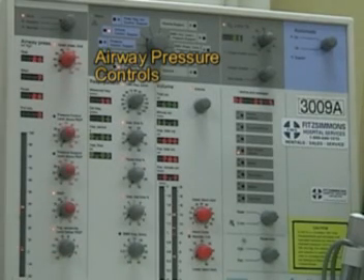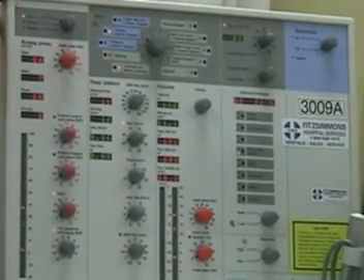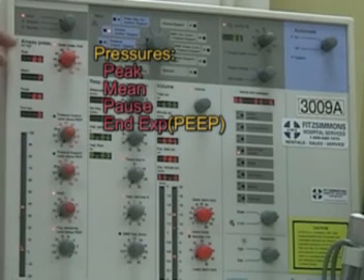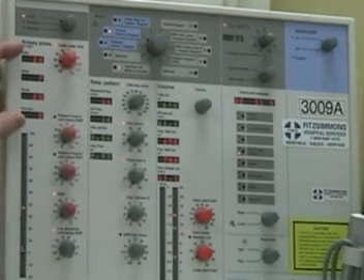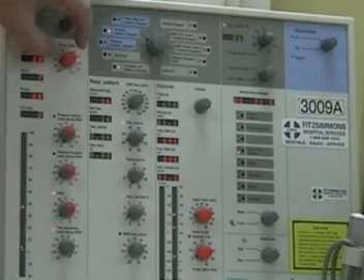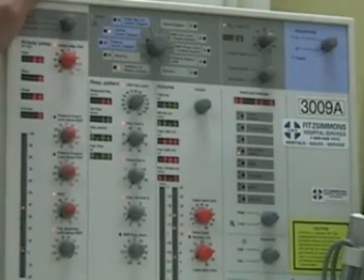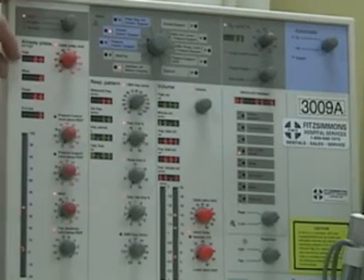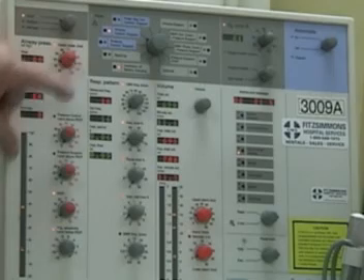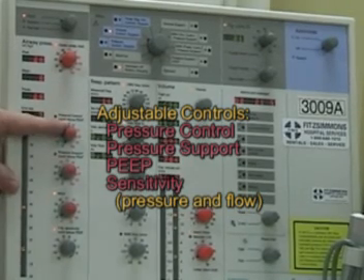Below the patient selection, from here down, is your airway pressure controls and monitoring. Note the red and green colors on the digital display — red indicates an actual measured value, green indicates a dial setting. We have digital readings for peak, mean, pause, and expiratory pressure (PEEP). The first red knob is the upper pressure limit alarm — the high pressure alarm — typically set 10 above peak, so if peak is 28 we set this at 38.